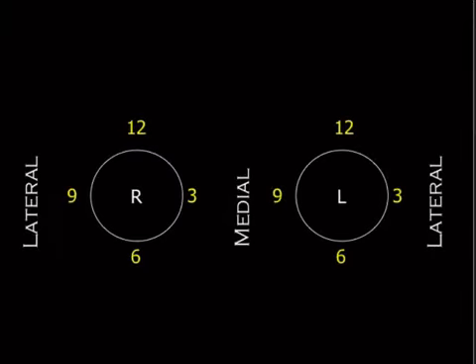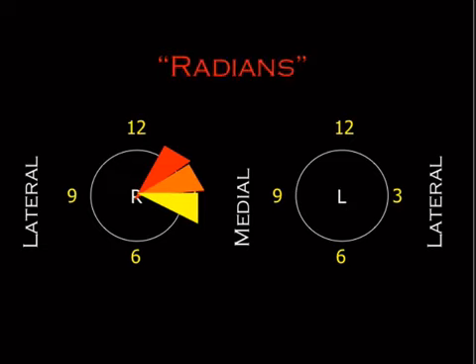More vocabulary here. People will talk about scanning the radian. So that's basically like the triangular, if you were going to draw triangles on the breast along the clock face, that's what people are talking about when they say radians.